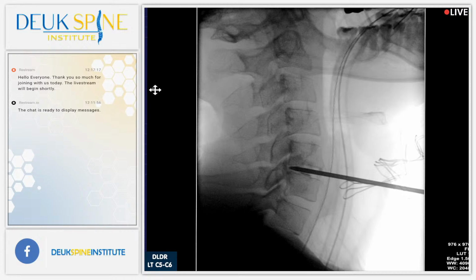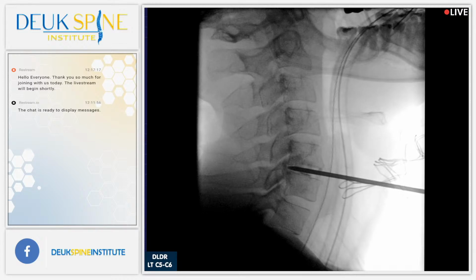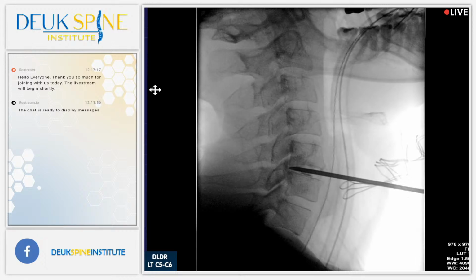Now we're advancing. Now you can see how the dilator tip is inside the tear. Go ahead and get a picture of that with the arrow there. Henry, another screenshot. Copy that. Not there. Show where, just put it at the tip. Right there. A little bit lower so you can see the disc part. A little lower. Right there. Shot of that right there, Henry. And send that to me. All right, good.